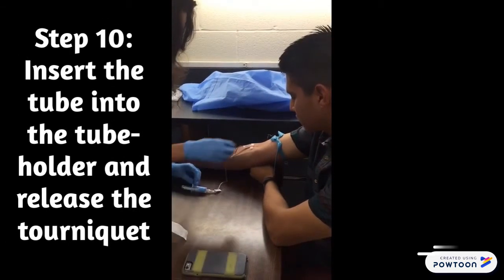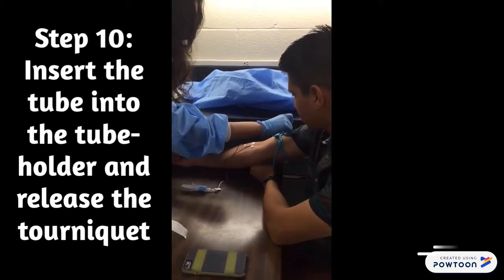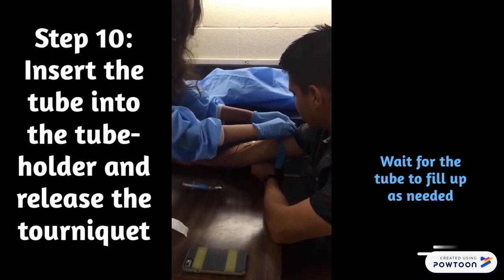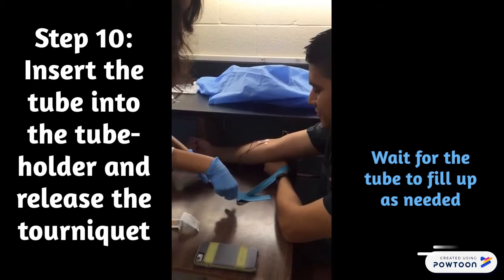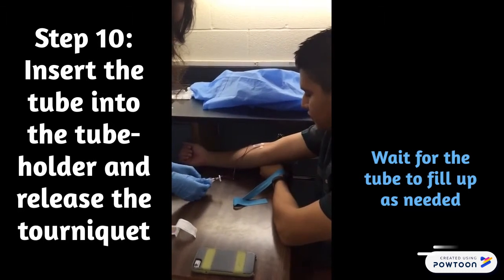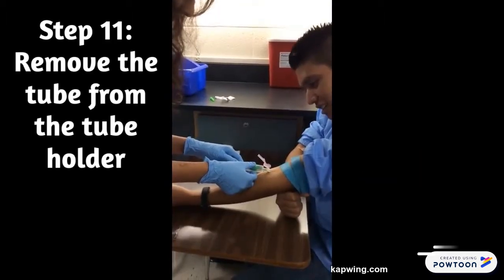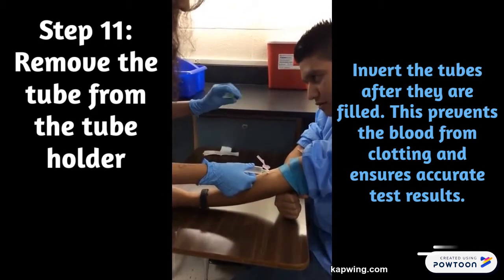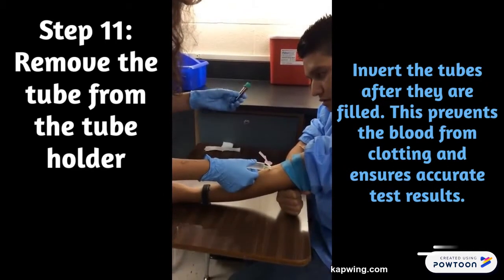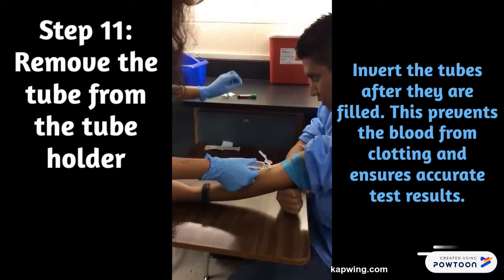Insert the collection tube into the tube holder and then release the tourniquet. Wait for the tube to fill up an appropriate amount. Remove the tube from the tube holder and invert the tubes after they are filled. This prevents the blood from clotting and ensures accurate test results.